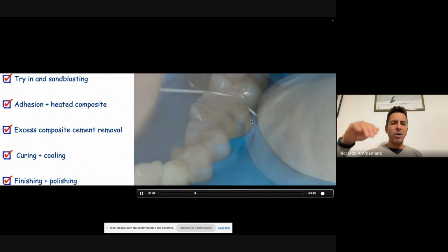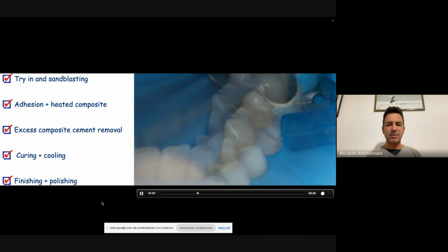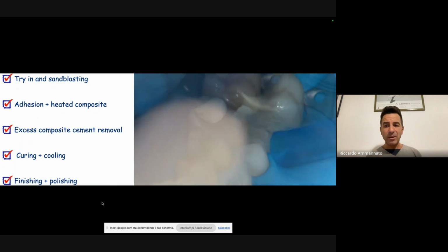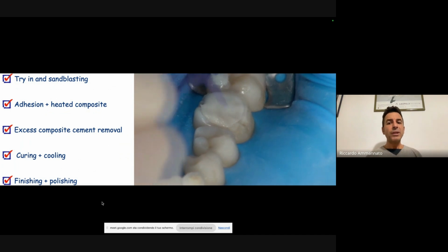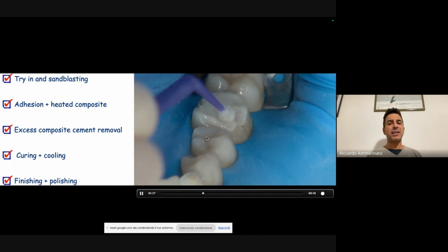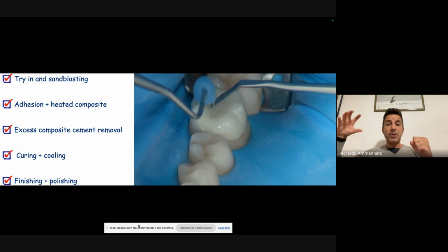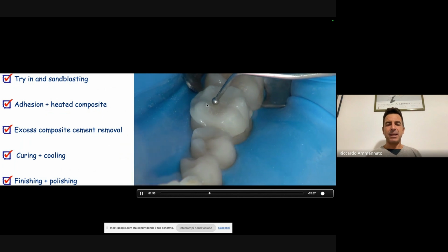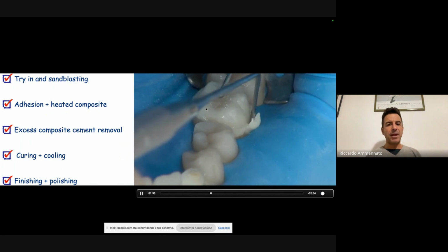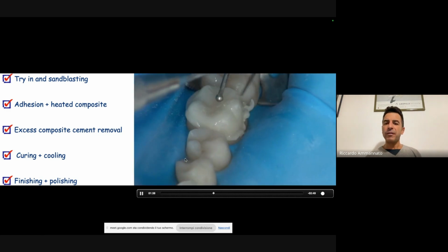And then I'm placing my bonding, just checking with some floss that no bonding excess is in the interproximal, thinning the bonding. And then either you use dual cure cement, or very often in these kinds of cases, I use the same composite that we use to do the fillings, heated up, okay? I place it on the tooth, then I land with my overlay, with my glass ceramic onlay. And you see here, the light of the unit is off.